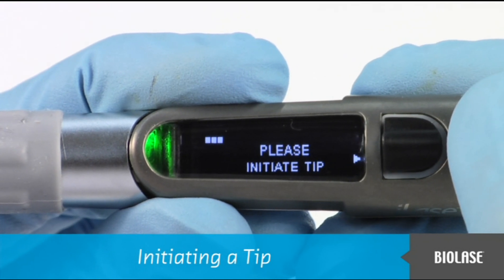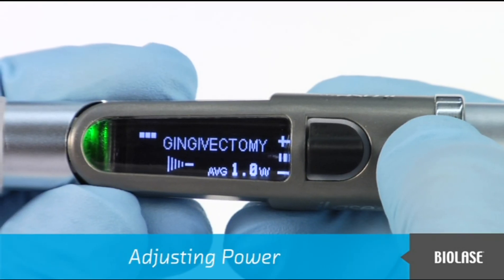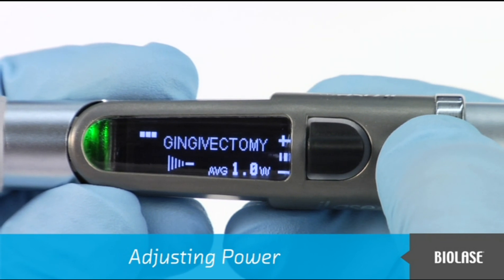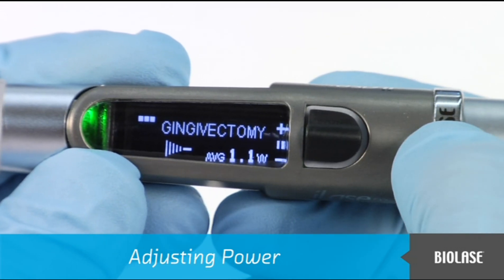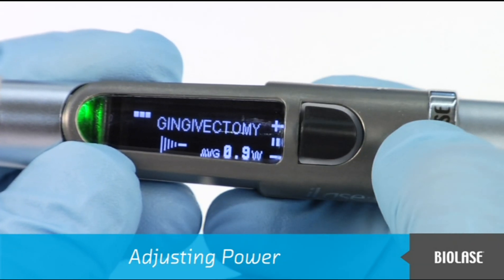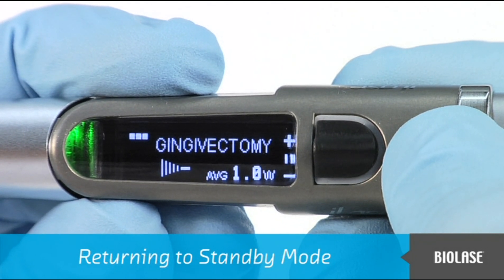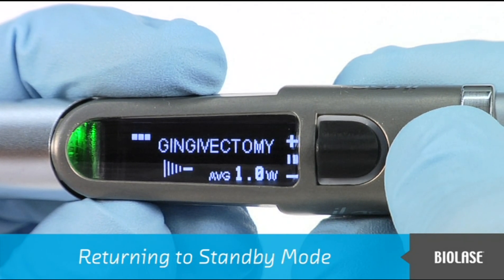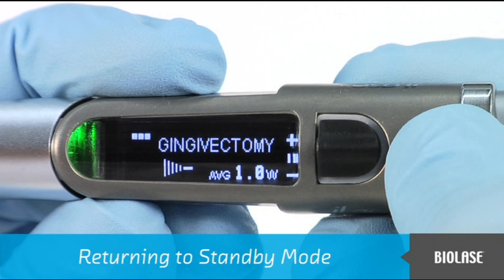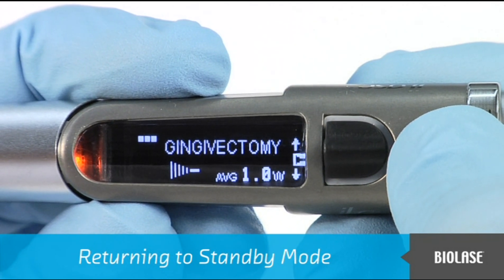Power can be adjusted during ready mode. First, make sure that you are not firing the laser. Then push the black navigation button up to increase power or push the button down to decrease power. The display screen will show the power level. Placing the iLaze into standby mode allows you to adjust all parameters of the system, including power, but the iLaze cannot be activated during standby mode. To return to standby mode from ready mode, make sure you are not firing the laser, then press in the black navigation button. When the LED becomes orange and the red aiming beam disappears, the iLaze is in standby mode.